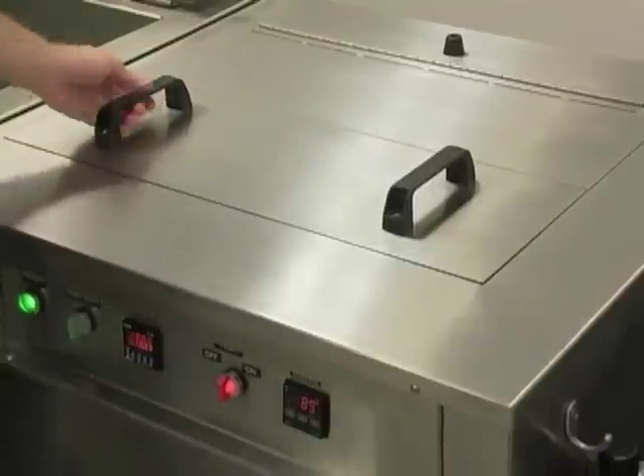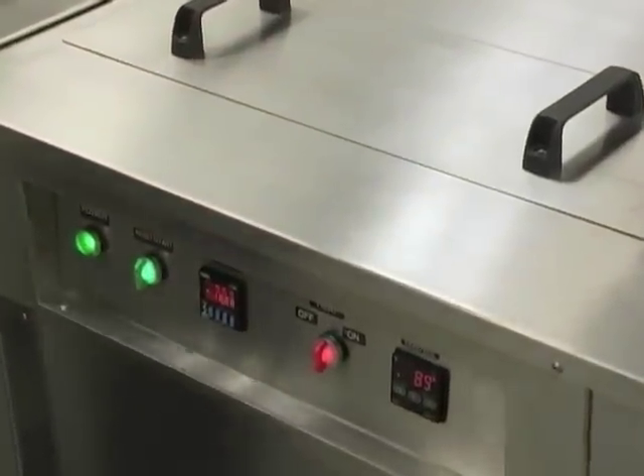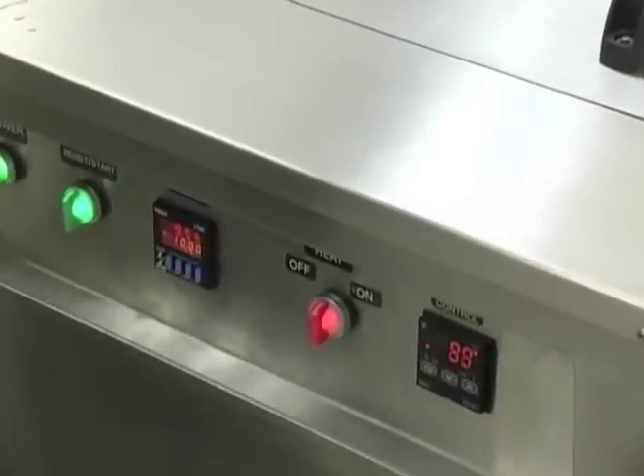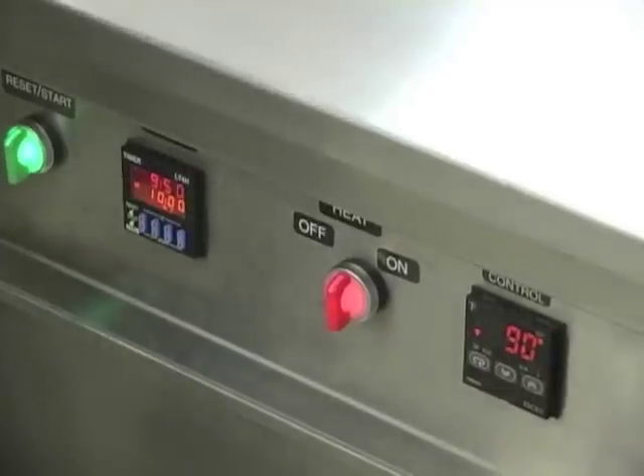Take it into the dryer — there are hooks on the side to hang it. Close the lid. Activate the dryer using the start button. As you can hear, the air is now blowing. The timer dictates how long the air blows for, and 10 to 15 minutes is the normal drying time.